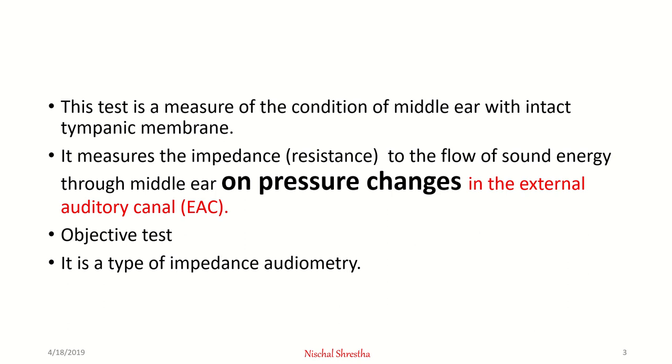And by changing the pressure, we can find the pressure at which that happens.